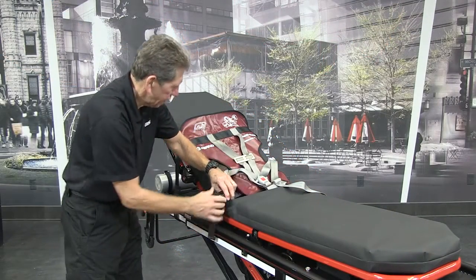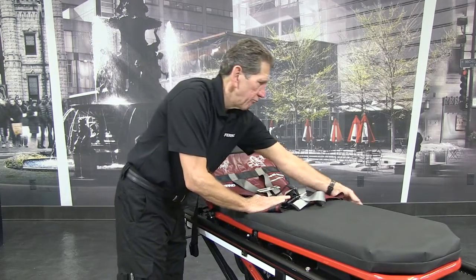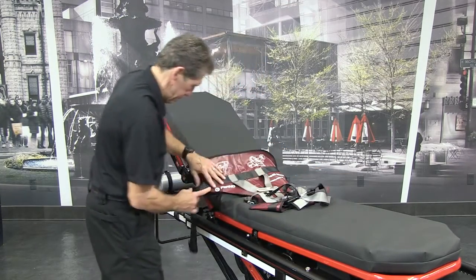Unfasten the backrest strap, fold it across the PDMATE, and make sure the mainframe straps are also laying on top of the PDMATE.